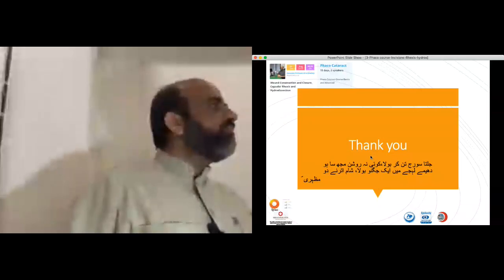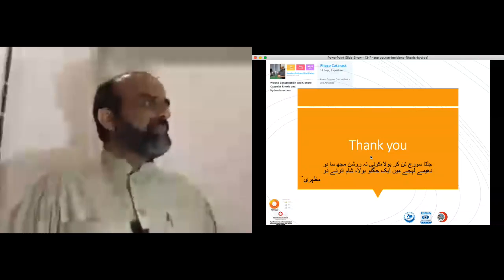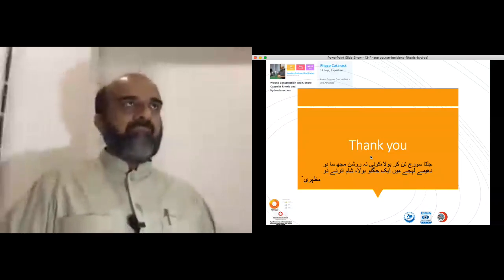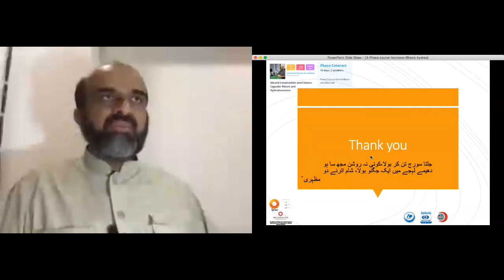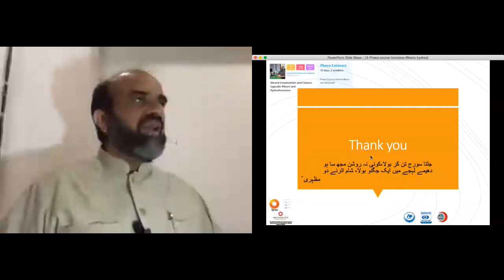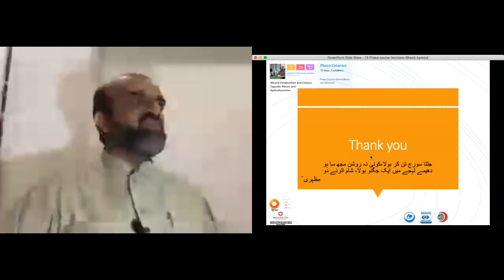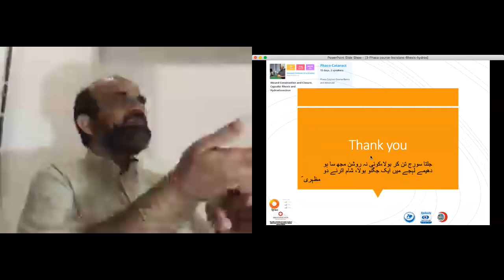What is the advice to beginners if he or she starts this and does not complete it? Dr. Naeem is asking about advice to beginners who are starting the rhexis. The first thing is don't try to go through your main phaco incision to begin with, because the main phaco incision is about 2.75 to 3 millimeters in size. And the second thing, which I keep on discussing but today I forgot to stress, is to use the lip as a fulcrum.